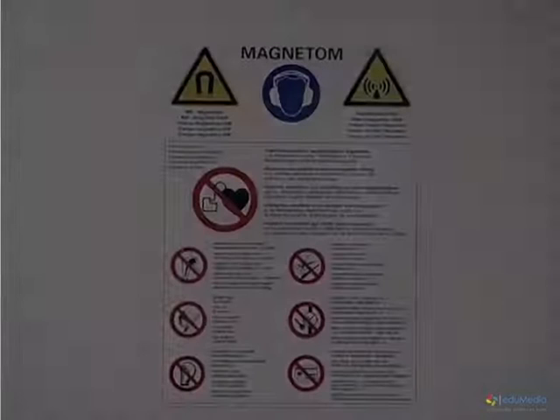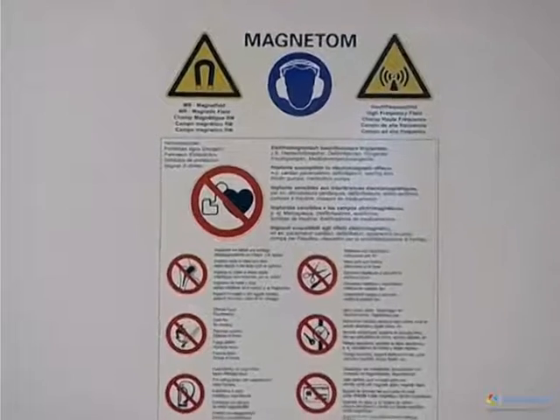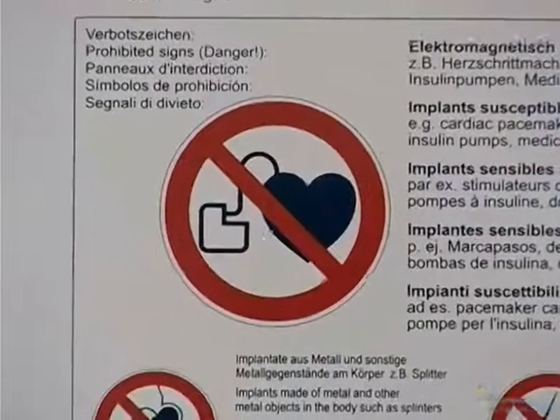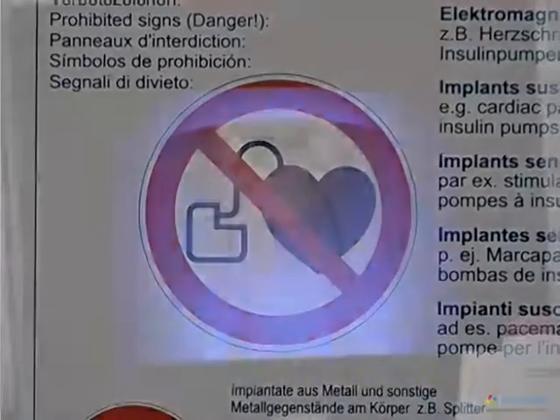The electromagnetic radiations used in MRI are painless and do not present any health hazard. On the other hand, certain precautions have to be taken because of the strength of the magnetic field. Thus, no metallic object can be allowed in the examination room, and the patient, like the personnel, must not be wearing rings, necklaces, or even makeup. Because of this, the examination is absolutely contraindicated for patients who have metal prostheses or a cardiac pacemaker.